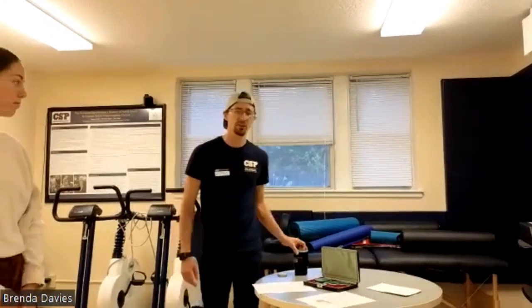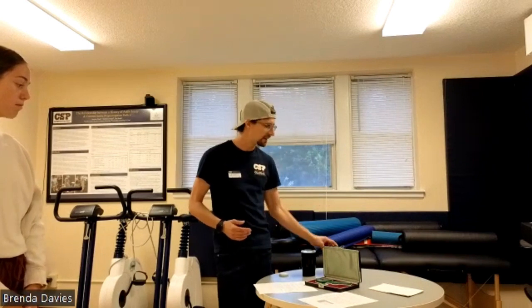BIA is fine, but you have to make sure that you're having a correct pre-assessment setup in that protocol. So make sure that you don't have any excess water. So like sweating, peeing, if you're sick, if you took a shower recently, within this time frame, if you drank a bunch of water, if you're a female and you're menstruating in a different cycle, you have that here as well.